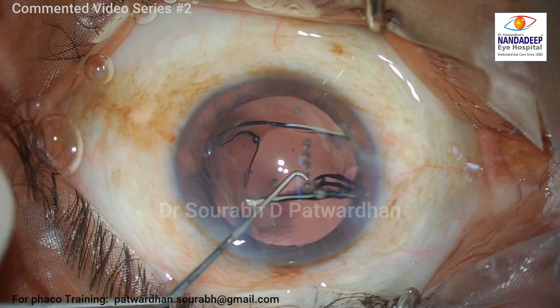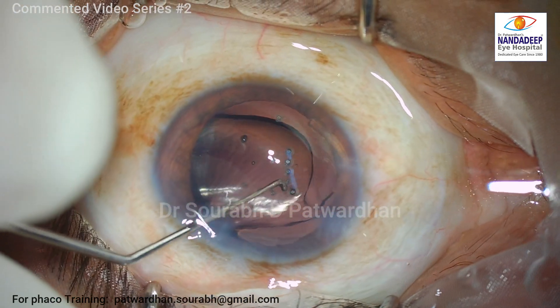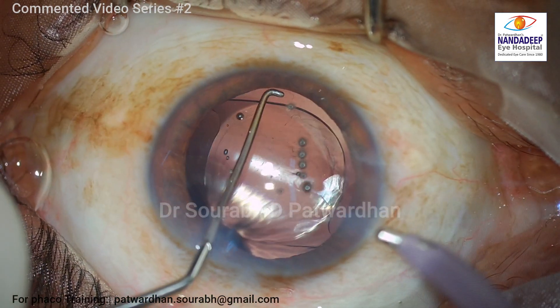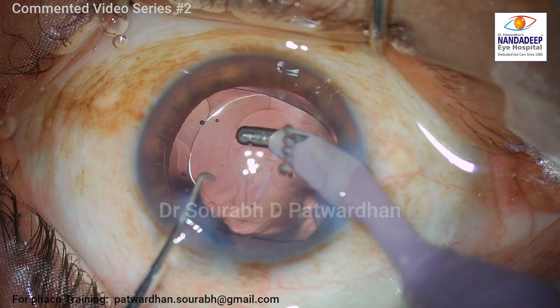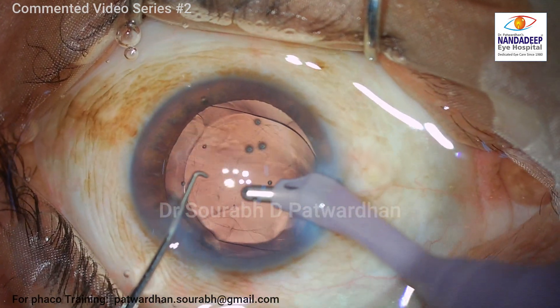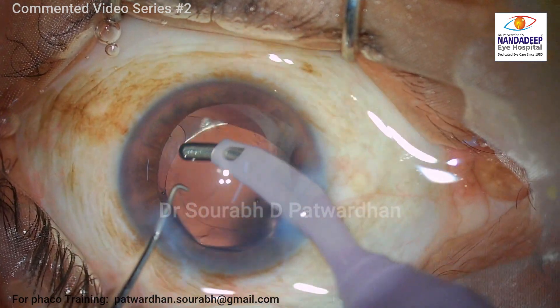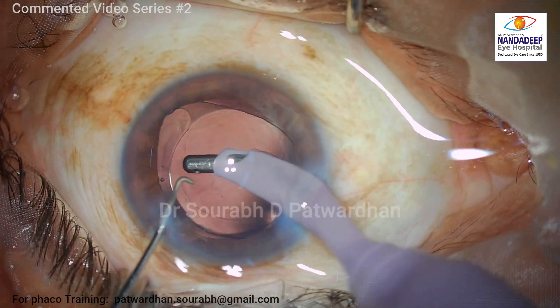This is the hydrophobic single-piece IOL which I have inserted in the bag. I always use the non-dominant hand to nudge the IOL in. Again here I expect LIDRS to occur, so what I am doing is lifting the iris before I enter the IA probe — so the patient doesn't get any discomfort. This is a good trick to follow in cases where the patient is sensitive to the stretch of the zonules; you can avoid LIDRS or reverse pupillary block by just lifting the iris up before you start irrigation.